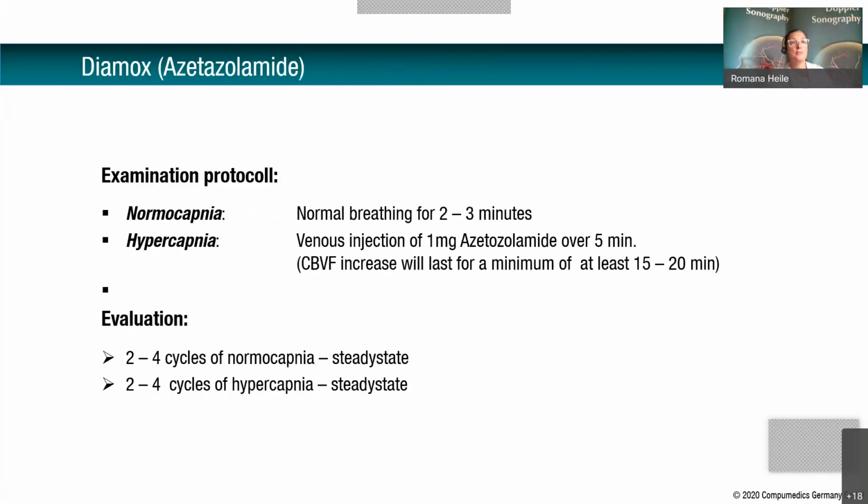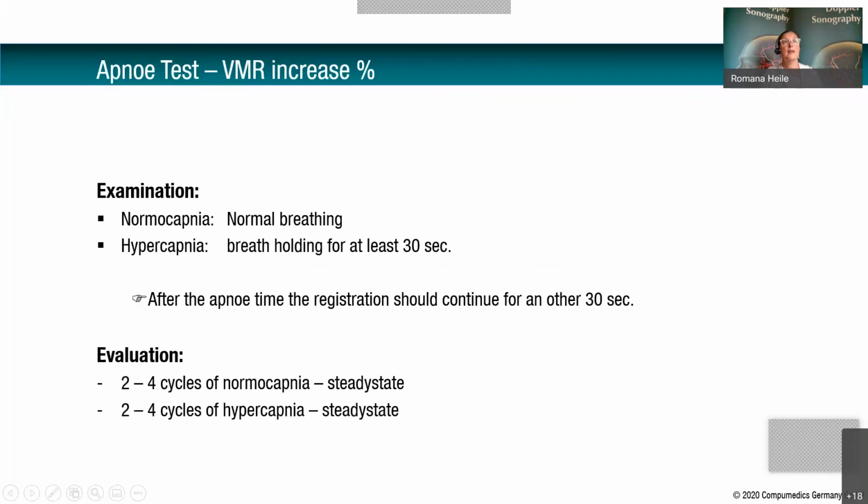So the examination protocol is more or less the same, or let's say the evaluation. We are looking for 2 to 4 cycles of normal breathing, and 2 to 4 cycles of the steady state. Same for the apnea test.